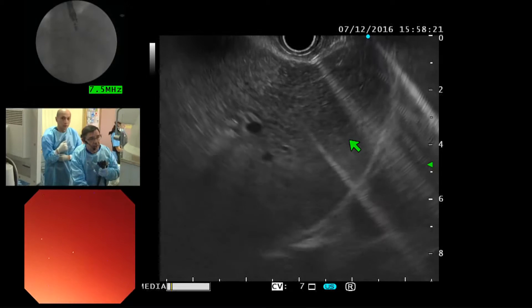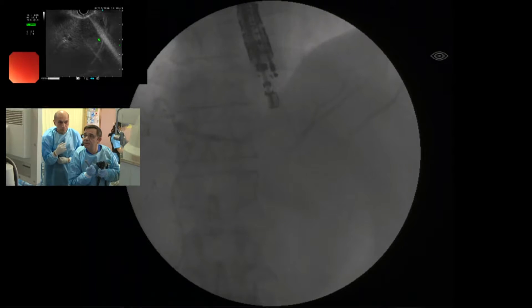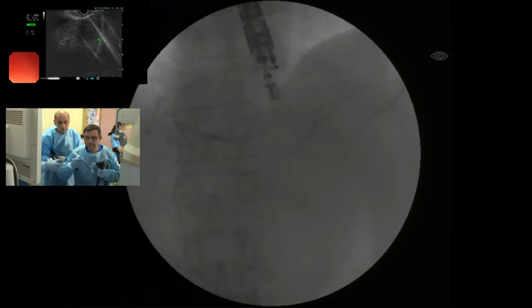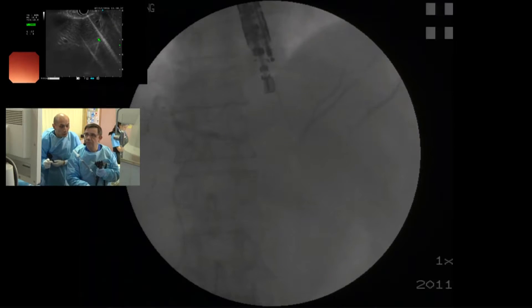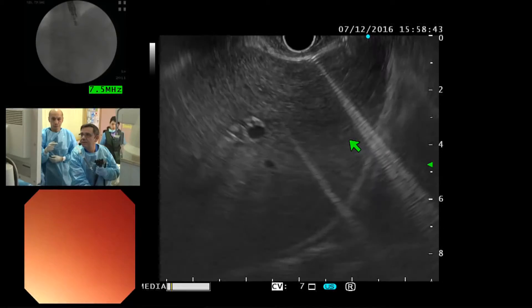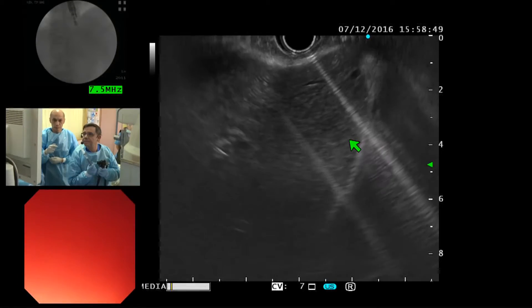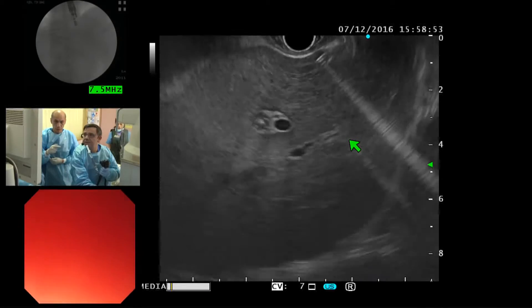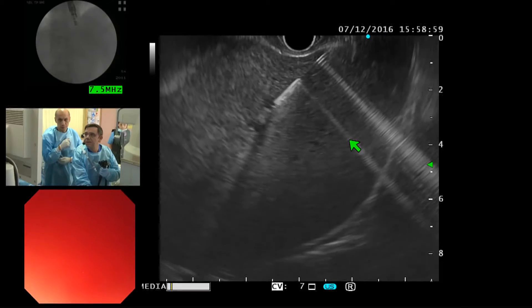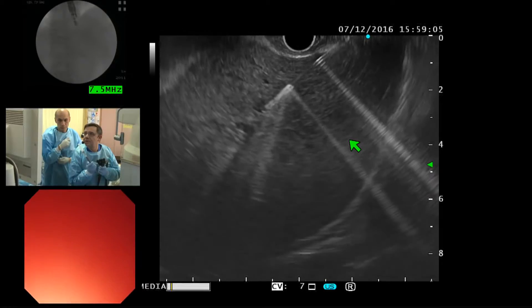Can I have a little bit more anesthesia, please? This is the contrast. No — the patient moved. I lost my position. Can I have more anesthesia, please? This is very important because the duct is very, very thin.